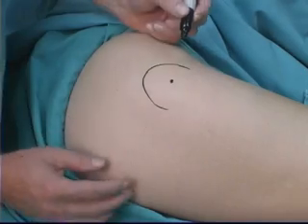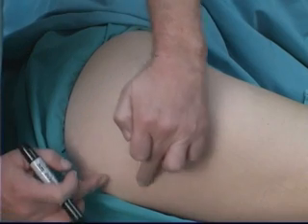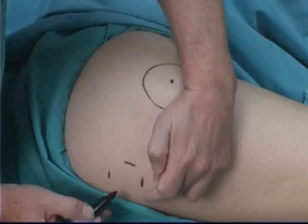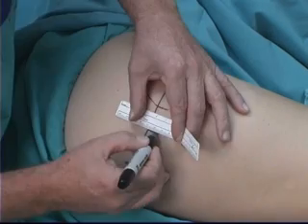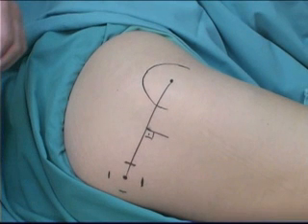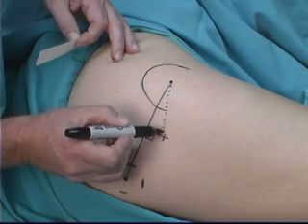The patient is positioned in the Sims position. The semicircle outlines the greater trochanter of the femur. Mark the midpoint of this and feel for and mark the midpoint of the ischial tuberosity. Draw a line adjoining these 2 points and measure and mark the midpoint of this line. Now draw a midline perpendicular to this joining line. This line is usually in a distinct groove between the iliotibial tract and the biceps femoris muscle and indicates the position of the sciatic nerve. The dotted line indicates the intended path of the catheter.